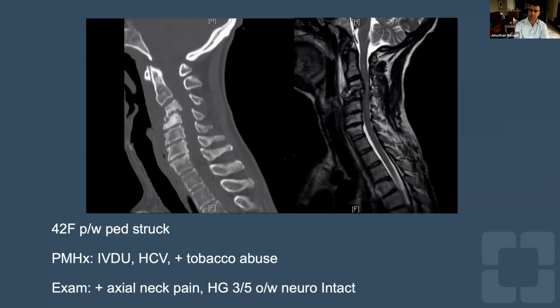What would be your choice of cage? Anterior titanium? I usually use an expandable cage for these. I use the titanium expandable. I don't think it's unreasonable to use a Harms cage. That's probably the best, right, as far as getting a true arthrodesis. Or you could potentially use a fibular strut, which I've used very infrequently.